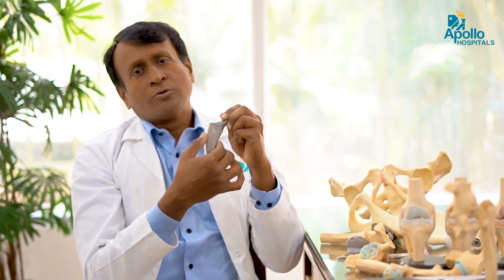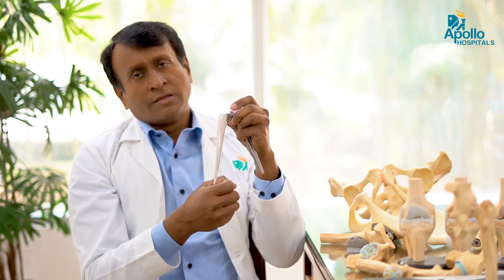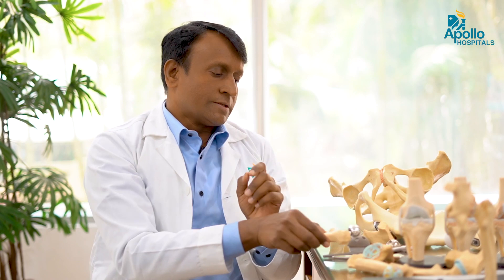To summarize: non-cemented implants are made up of titanium with a porous surface where bone will grow onto it. In cemented fixation, there is no bone growth — cement acts as a filler where the stem is fixed to the bone. This is how cemented and non-cemented fixation differ.